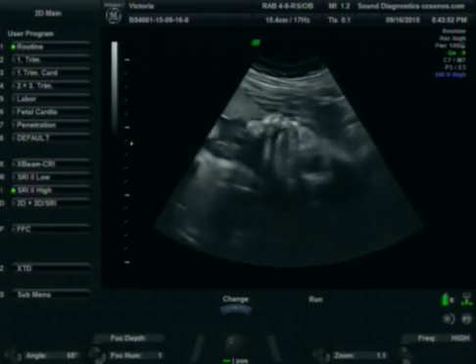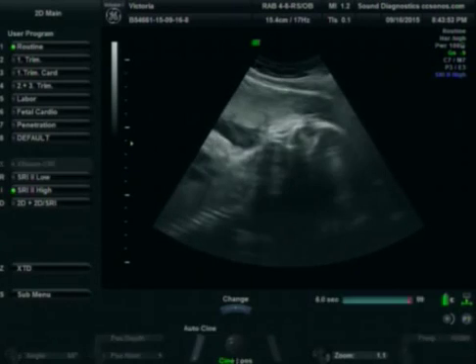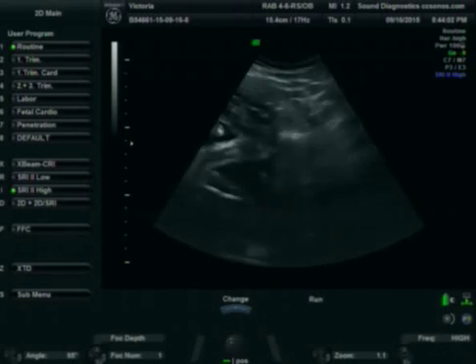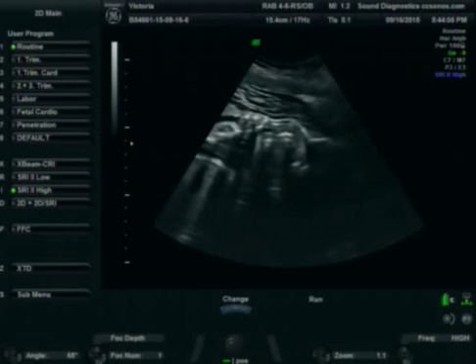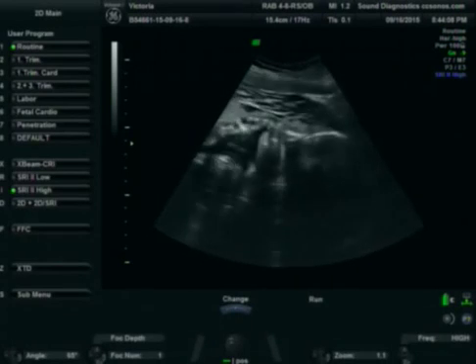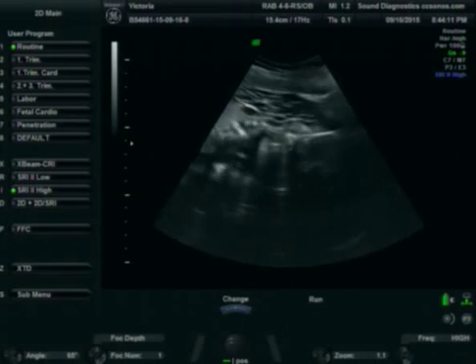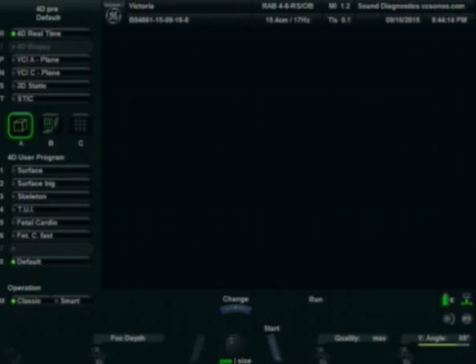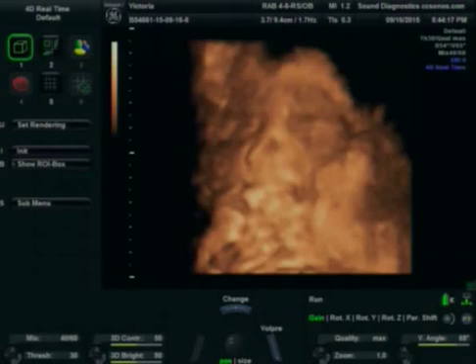Alright, since baby's face is towards your left side, why don't you try turning to me all the way this way. See if the baby won't fall away from the side of the uterus a little bit. He's like, leave me alone. That's how she was when we did the other sonogram. I had to turn sideways. It's best if you're on your side anyway. Babies can compress on your main vein in your back, your IVC, and kind of make you nauseated. You're not supposed to spend much time on your back.